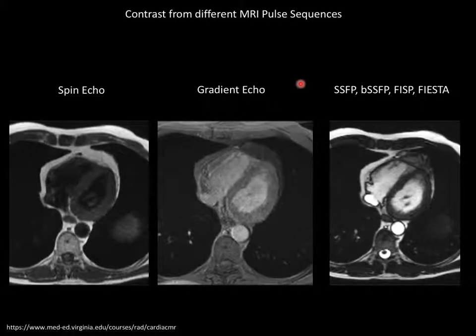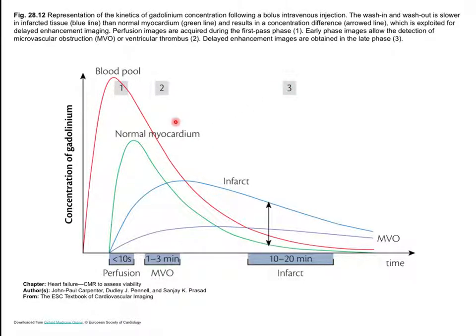What we'll look at briefly is concentration kinetics as measured with MR, and it's a very simple experiment. It's much like the nuclear medicine experiment where you inject an agent into the patient's vein, and then you watch the signal intensity as a function of position in the heart and see whether or not the agent gets there and how long it spends there.